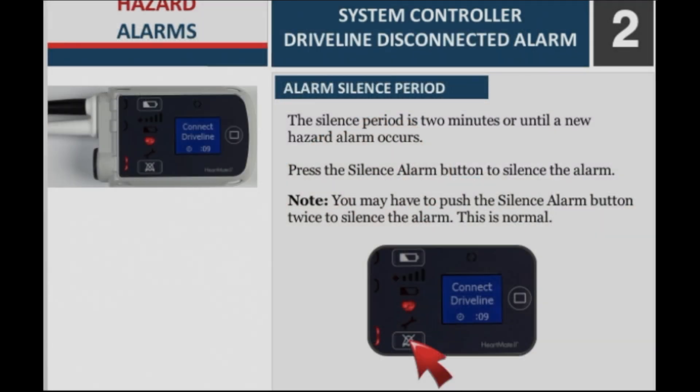Alarm silence period: The silence period is 2 minutes or until a new hazard alarm occurs. Press the silence alarm button to silence the alarm. Note: you may have to push the silence alarm button twice to silence the alarm. This is normal.